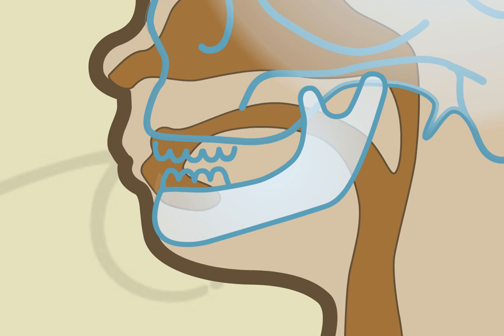Once the distraction is stopped, the distractor is kept in place for three months to allow bone healing.